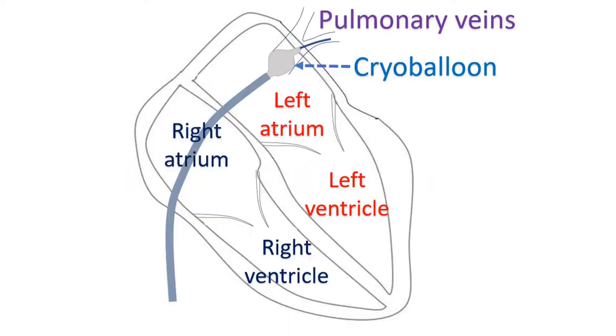Cryoballoon ablation is a special type of cryoablation in which instead of the usual cryocatheter, a cryoballoon is used for circular cooling. While doing ablation in pulmonary veins for atrial fibrillation, cryoballoon ablation avoids missing of abnormal regions. Pulmonary veins are blood vessels returning oxygenated blood from the lungs to the left atrium. Left atrium is the left upper chamber of the heart.